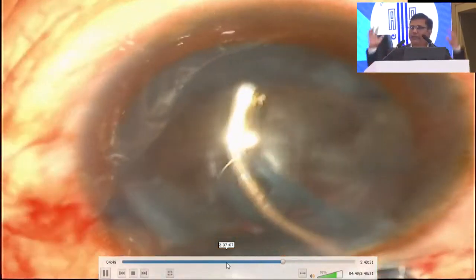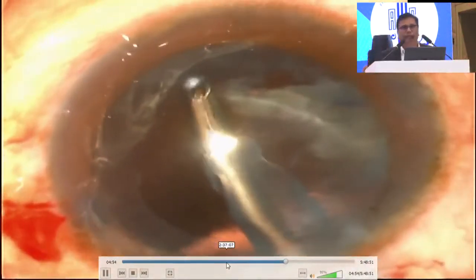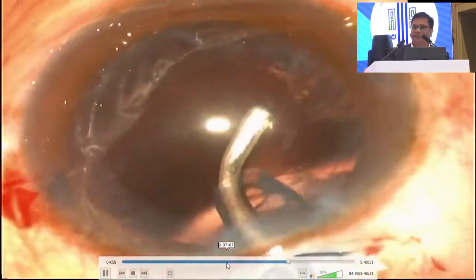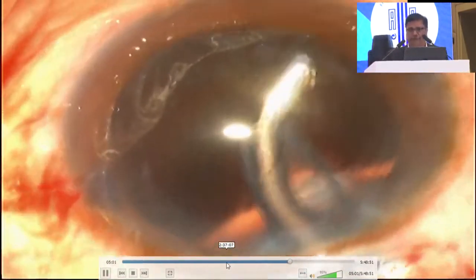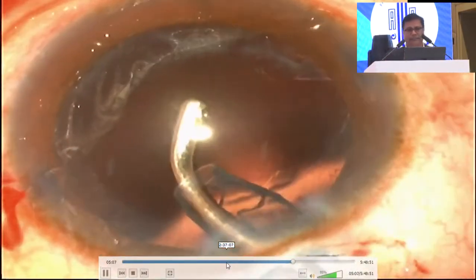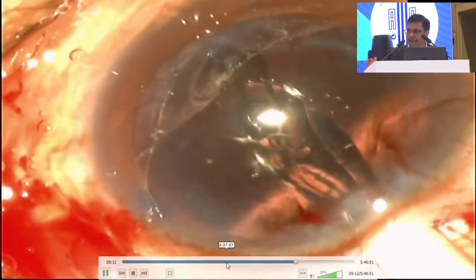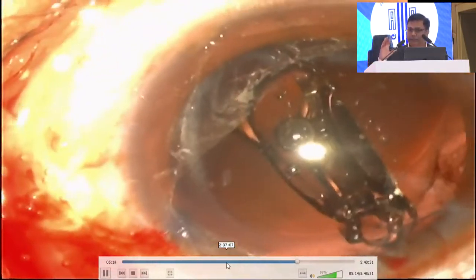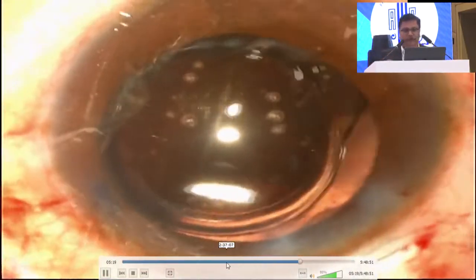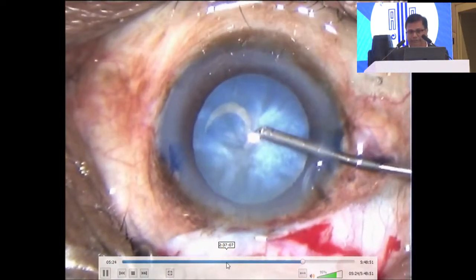Dispersive viscoelastic. If you protect your endothelium, then there will be no damage to the cornea. Coaxial irrigation aspiration I am using. Bimanual is a choice in such a situation, which maintains the architecture. And before coming out, you can put the viscoelastic. That is another very important point. The rhexis has run away, but you can see, you can feel that rhexis and all that, so that you can put whatever IOL you are having, whatever you have decided.